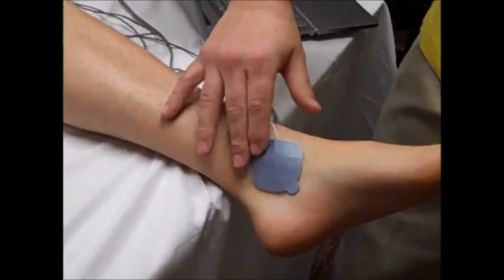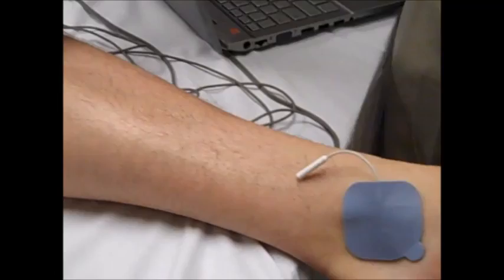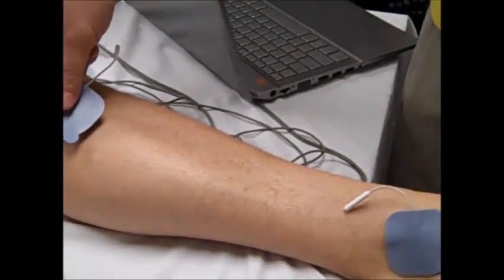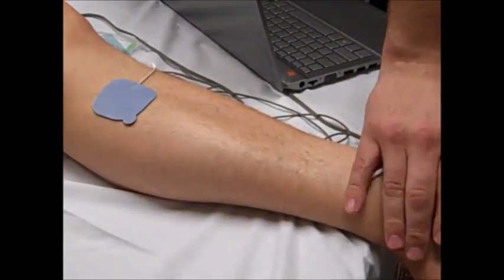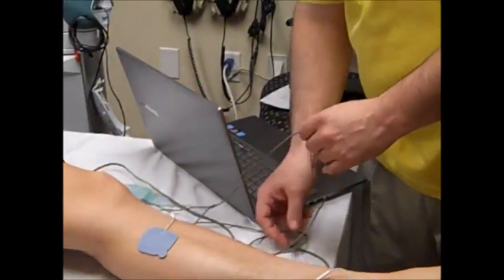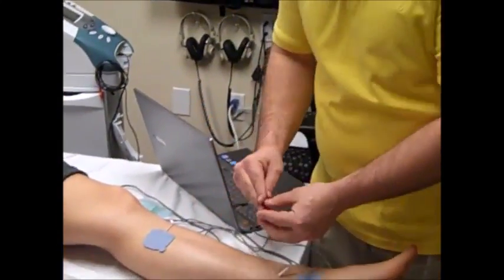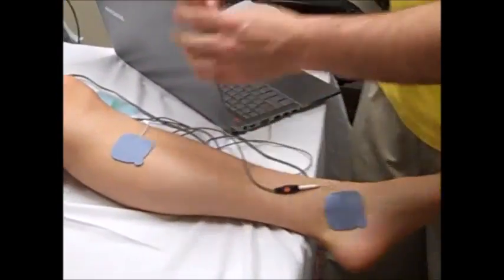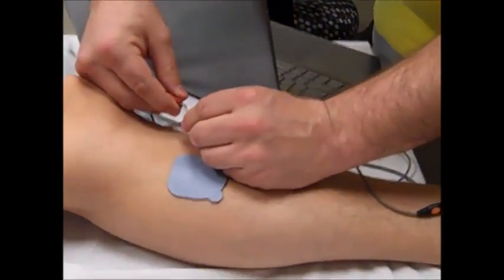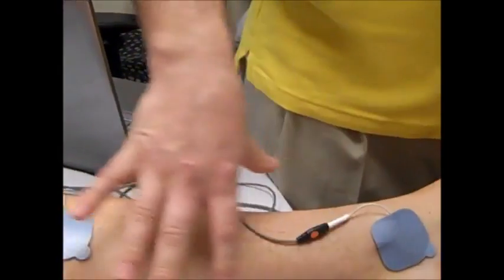Place the electrode right here on the side, and you also want to place the dispersive electrode higher, usually about 12 to 18 inches — I try to go right about here, more of the muscle belly. Since this has more edema in it, we're going to use the negative. Like charges repel — the black is negative — so we'll go here, and the red is positive. We're going to use the negative to repel and the positive to help pull the swelling up.